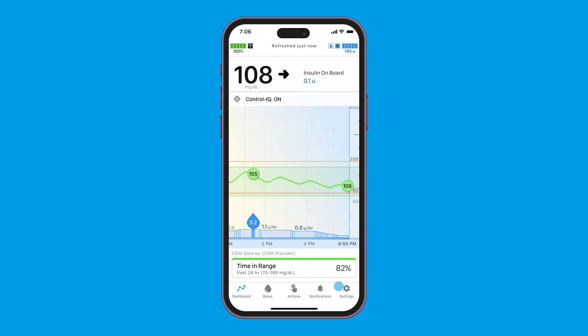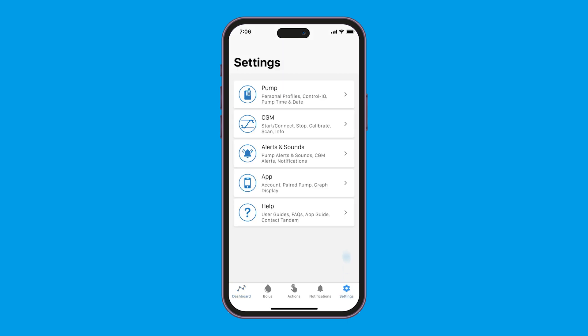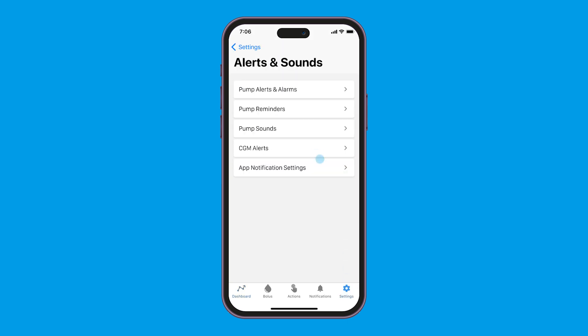You can enable push notifications through the Tandem Mobi mobile app. Just tap settings, then alerts and sounds, and then app notification settings.